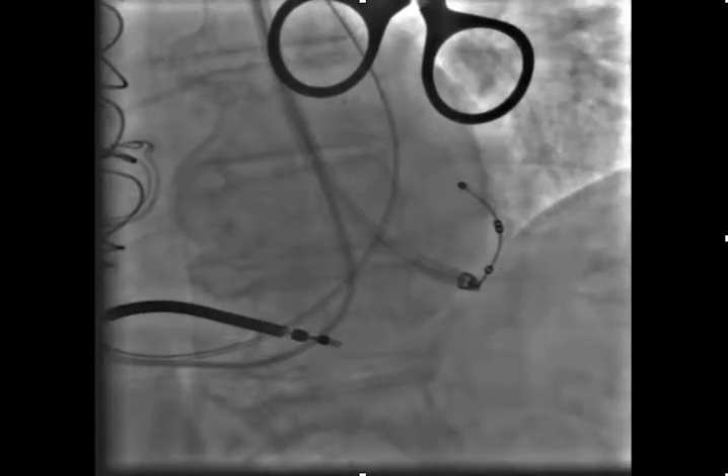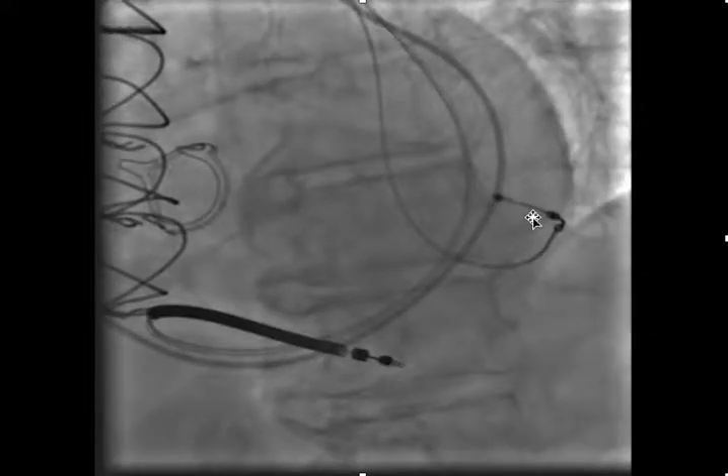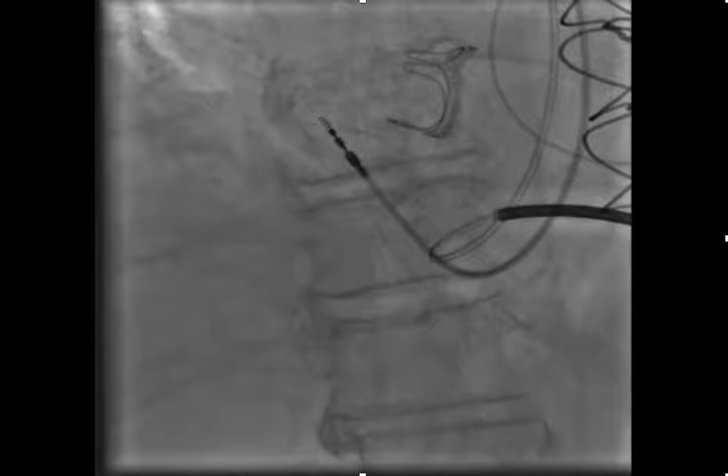Now with all sheaths removed, here's the LV lead, the RV lead, and the RA lead all in position — a functional system with capture thresholds less than one volt. Thank you for your interest. This is an uncommon anomaly, probably one in ten thousand, so you may never see one, but if you do, you now have some idea of how to approach it.